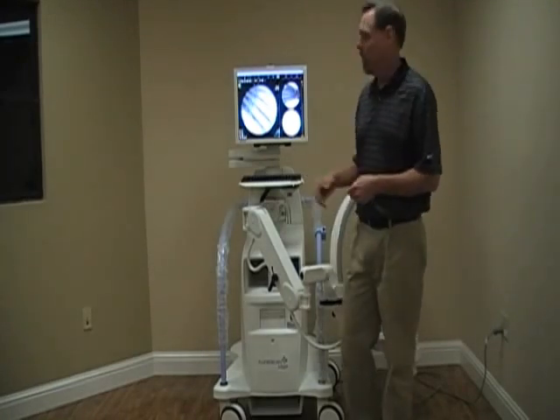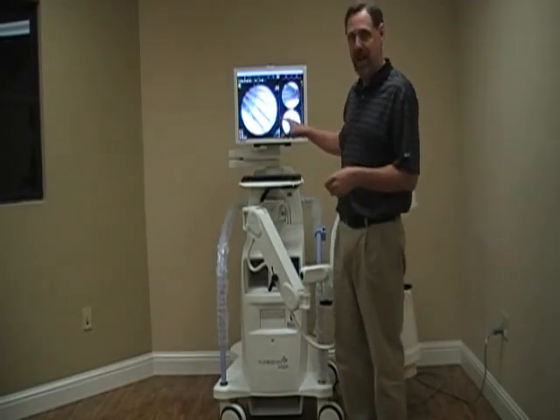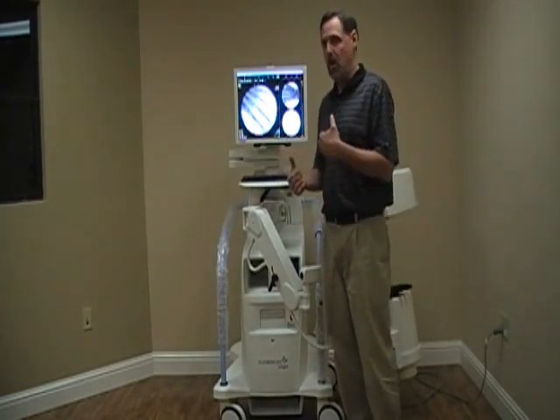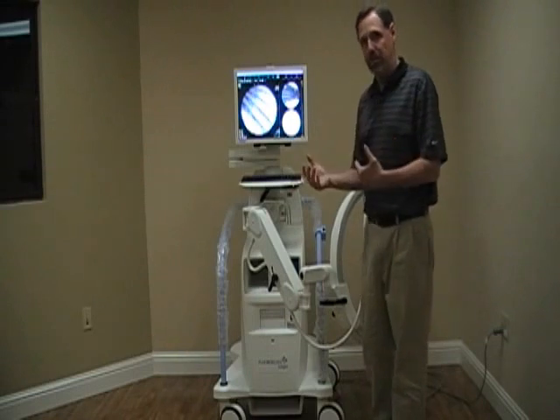We turn the system on, wait for the Perform/Review/Shutdown screen, hit Perform, put in the patient information, hit Perform again, and we're good to go. We take our case. We're now done with the case.